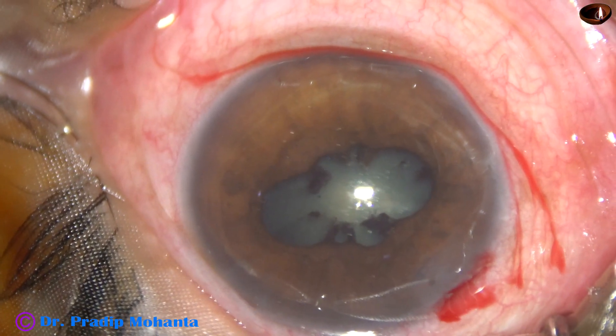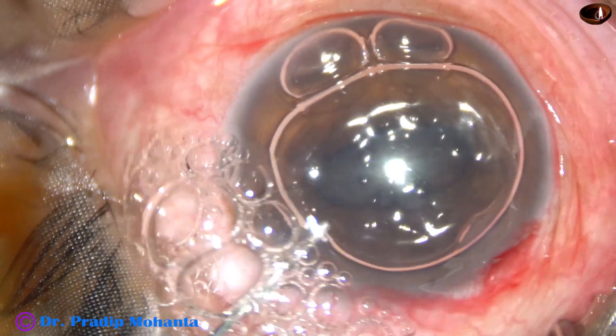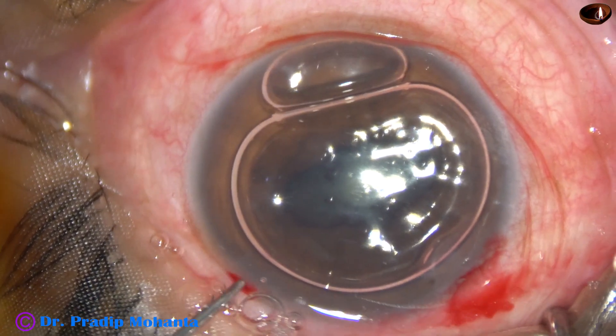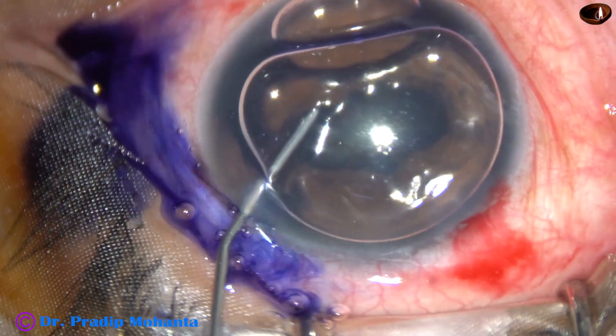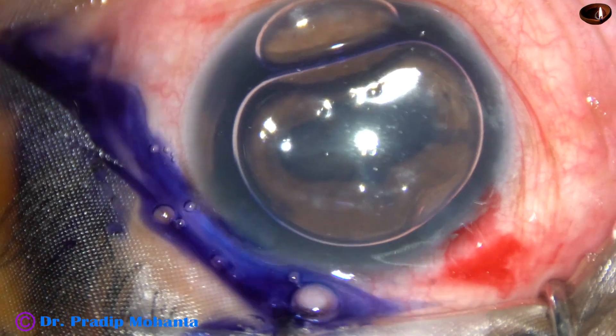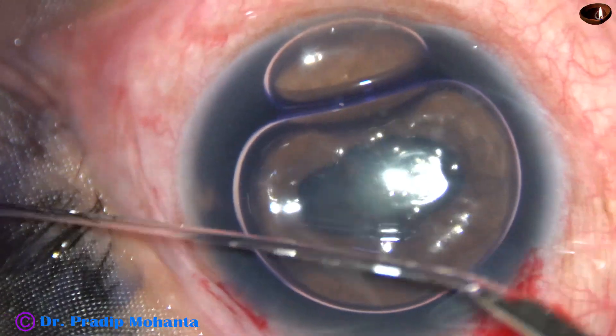The plan is to stain the anterior capsule with trypan blue dye. Before that, I inject an air bubble. Behind the air bubble, I inject the dye in the anterior chamber and behind the iris. Otherwise, the staining will be only in the visible area. So now the staining will be good.